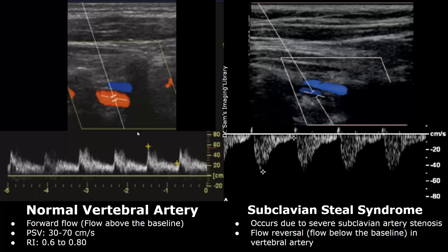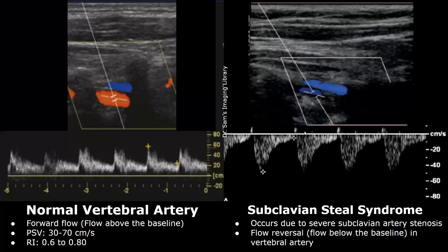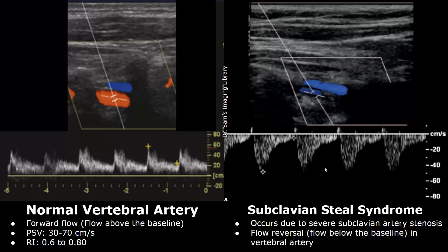This is a normal flow in a vertebral artery — there is forward flow and the waveform is above the baseline. Over here we have a vertebral artery in the setting of subclavian steal syndrome. There is flow reversal in the vertebral artery due to severe stenosis in the adjacent subclavian artery. The waveform is seen below the baseline.